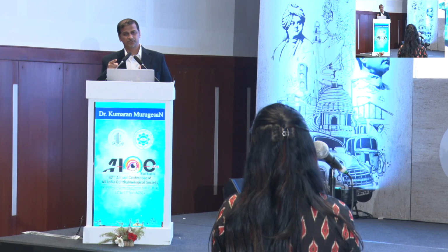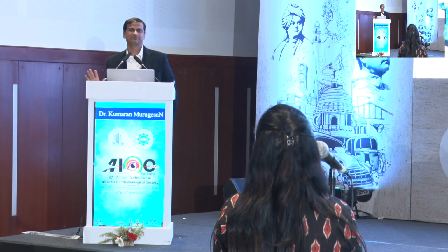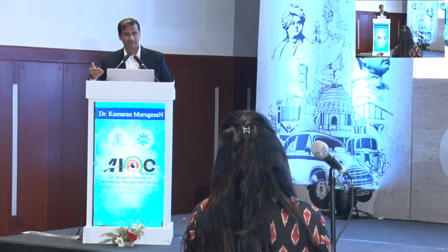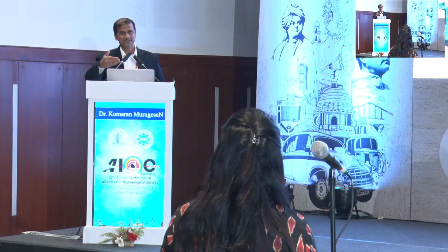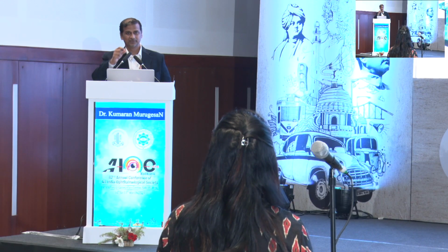In these situations, your phaco crystals and your sharp instruments will get damaged. So if you do not know all these processes, these people will take you for a ride. In that case, you have to show all these indicators, the auditing and the documentation to show that we have never crossed the particular temperature.